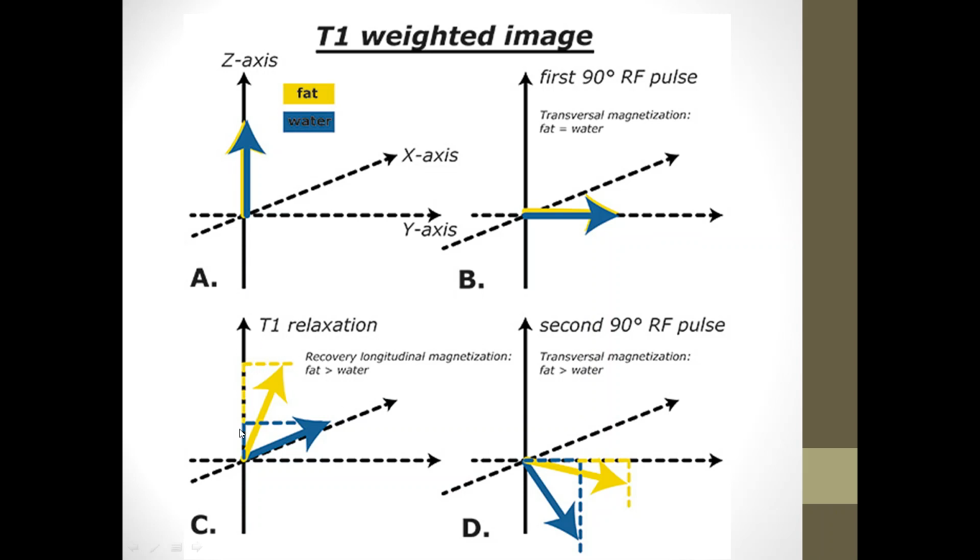We depend on imaging longitudinal magnetization here. So the T1 weighted image, that's the reason why the T1 sequence depends on imaging of T1 magnetization, or longitudinal magnetization. So the fat here appears very bright, more than water, which is dark. This is the T1 sequence.